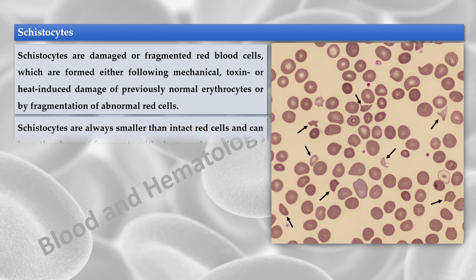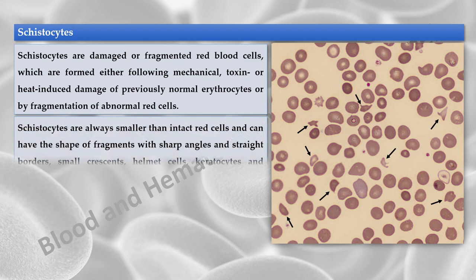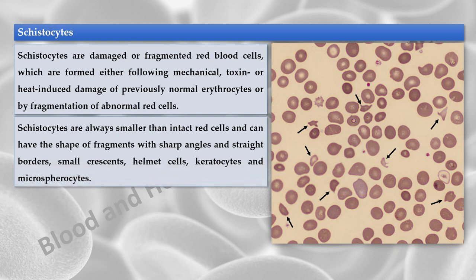Schistocytes are always smaller than intact red cells and can have the shape of fragments with sharp angles and straight borders, small crescents, helmet cells, keratocytes, and microspherocytes.